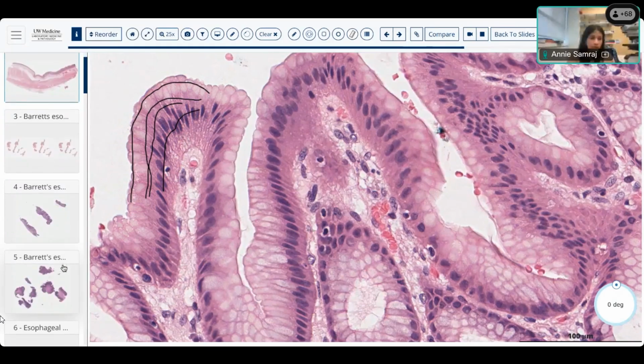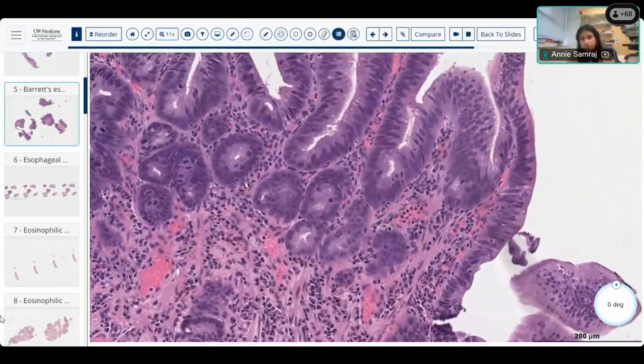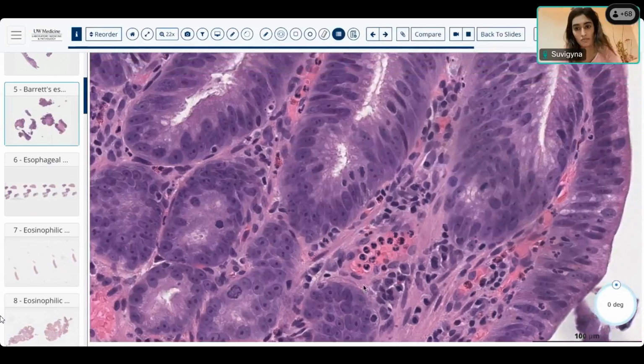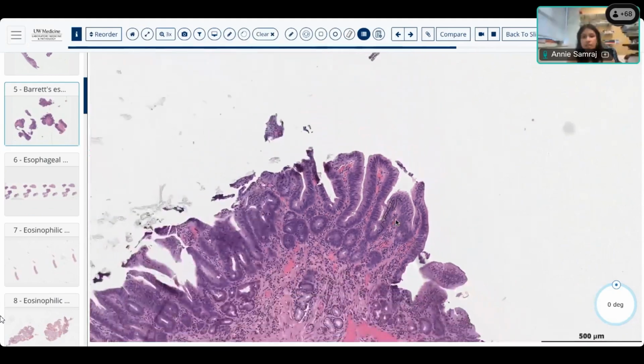If you look at a case of dysplasia, do you see here, first of all, we don't have the first line. There's no apical mucin, right? So we only have the cytoplasm. And if you look at line 4, the nuclear line, it's not a straight line, right? It's kind of jumbled all the way. So this disorganization of the lines is what you see in dysplasia.